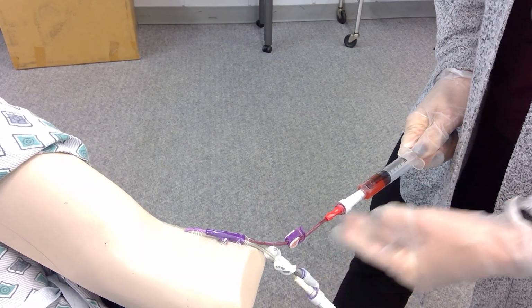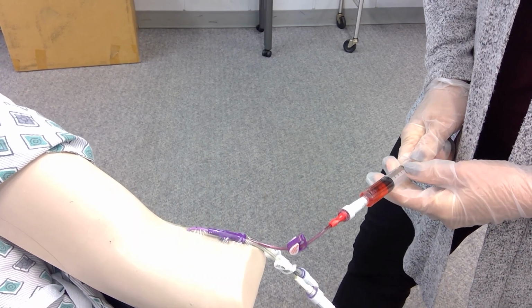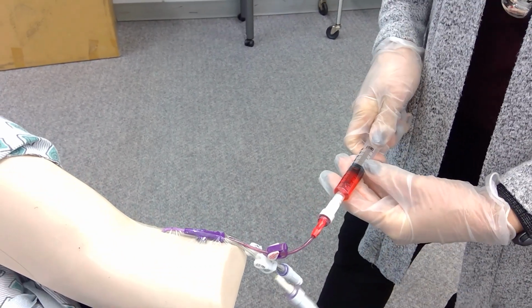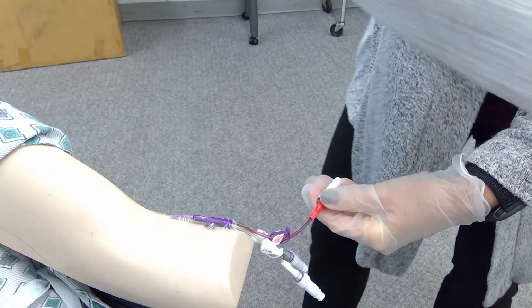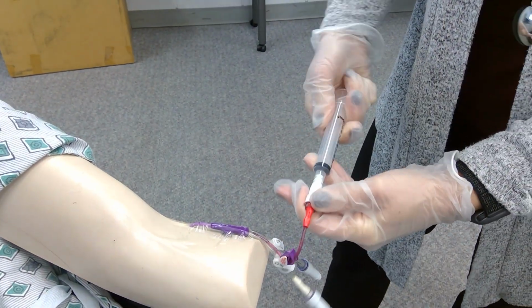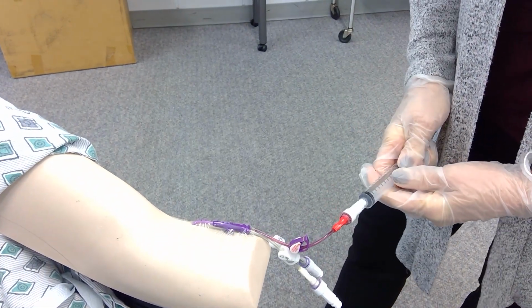Now, depending upon your facility, you may have to waste more, depending upon your policy in your specific facility. So once I get to the 5, I'm going to clamp, and that is going to be my waste. That's what I'm going to throw in the waste container. I'm going to attach my second syringe, and this is going to be the sample that I'm going to send to the lab.